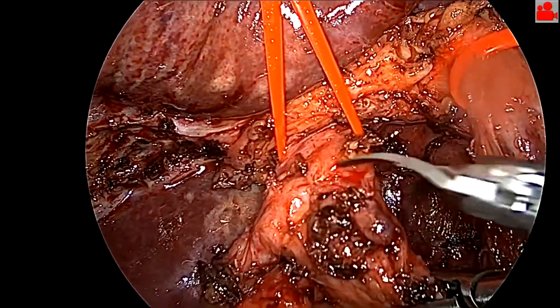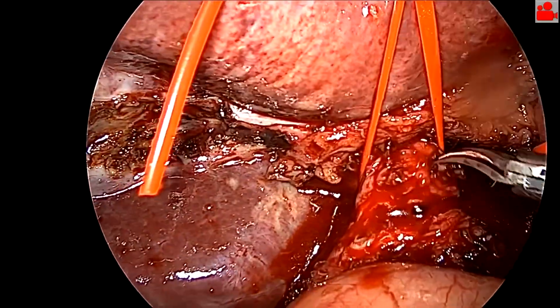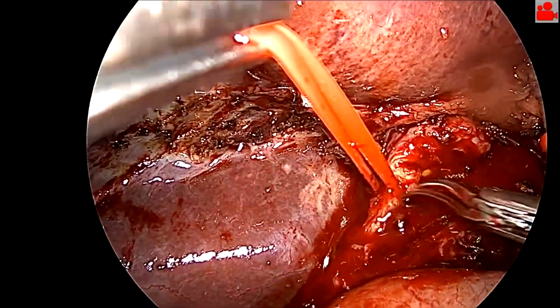After mobilizing the common bile duct, we proceed to transect it in a relatively high position, taking into consideration the aspects of bile duct blood supply, avoiding the middle least vascularized area.